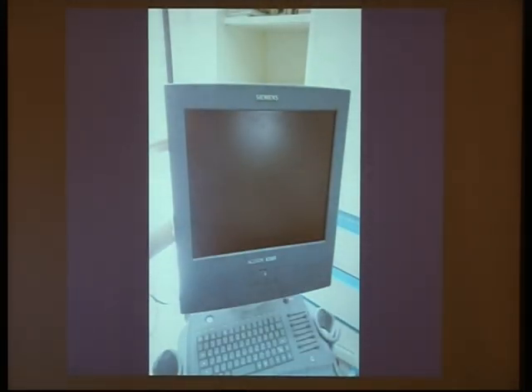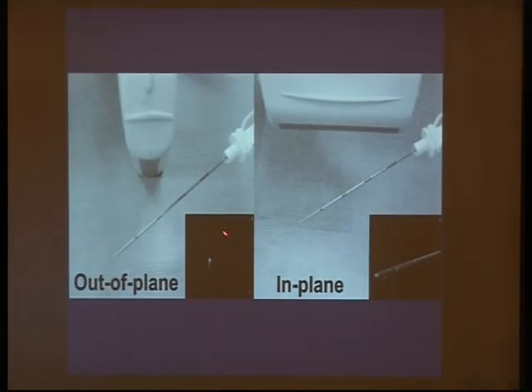As I have just mentioned, the use of ultrasound is almost mandatory nowadays to cannulate central veins. And this is ultrasound probe. If we use transverse position, this is also called out of plane, because this is the plane of ultrasound, and we will meet the plane at one point and then we will lose it again.